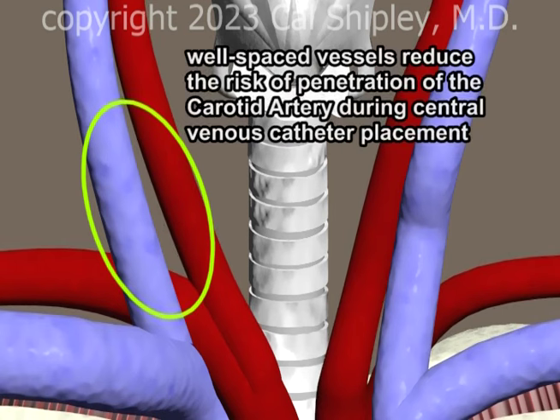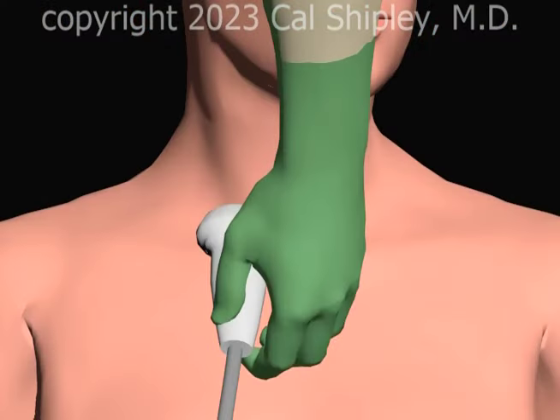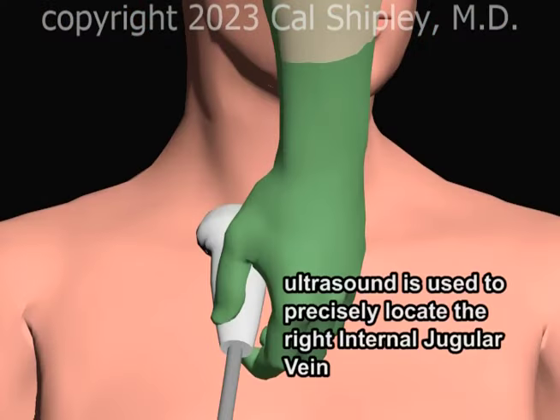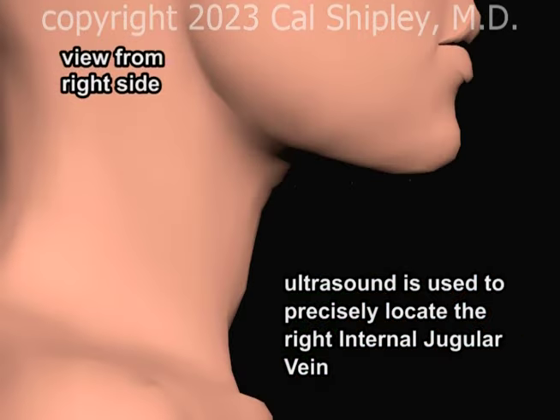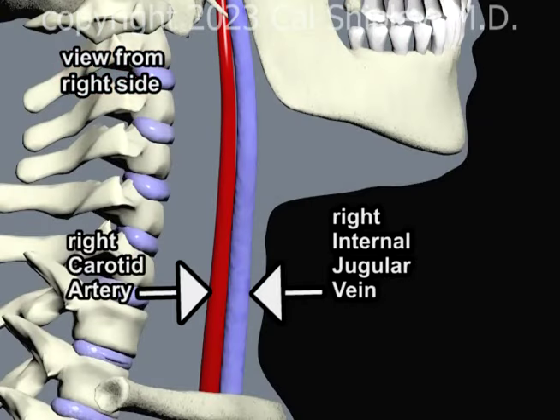Well-spaced vessels reduce the risk of inadvertent and potentially catastrophic penetration of the carotid artery during central venous catheter placement. Once vessel spacing has been assessed and the side chosen for the initial placement attempt, ultrasound is used to determine the precise location of the internal jugular vein.